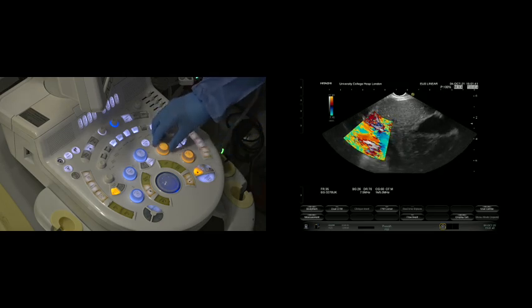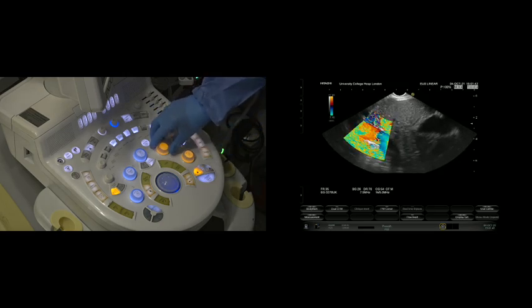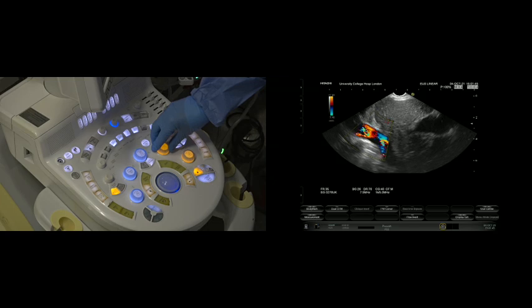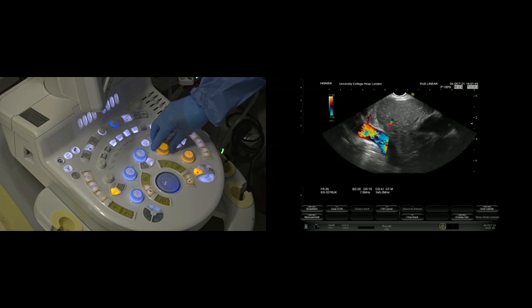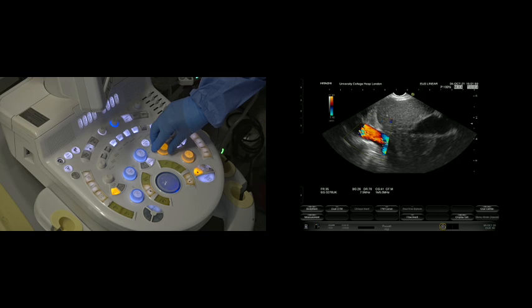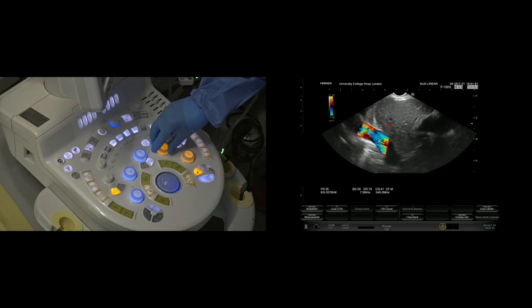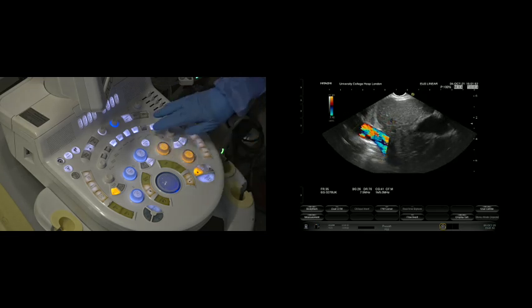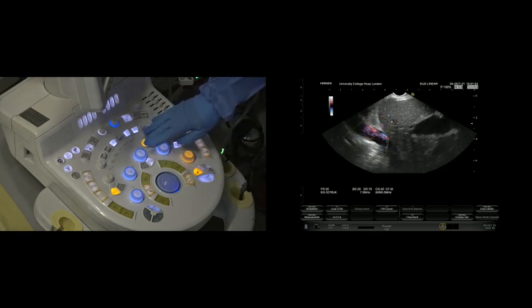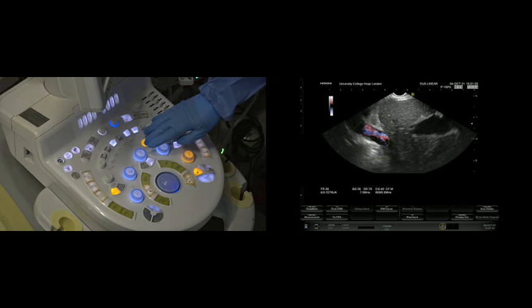It's a good idea on your way down to the lesion of interest that you've calibrated the Doppler gain so that it's right in the middle there, so real vessels are showing up. You've then got your fine flow, which can sometimes be even more sensitive.